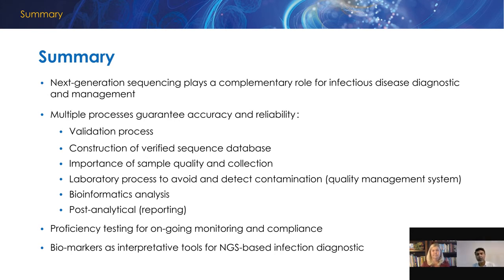If it's possible, use matrices. Let's say that you're running sequencing from a bronchoalveolar lavage, and you are able to use known matrices to develop those quality controls, especially for the extraction portion. I think that would be ideal.